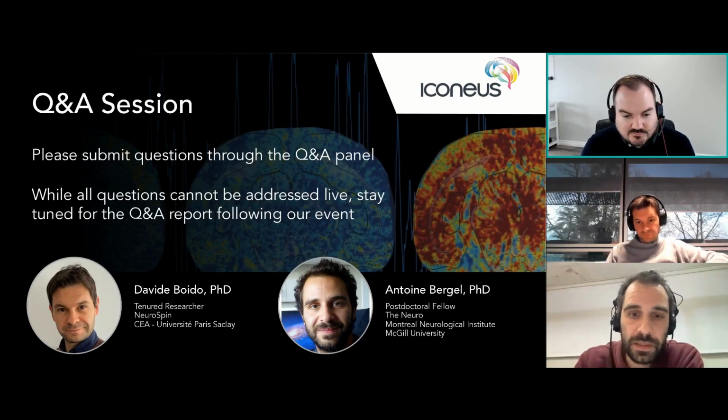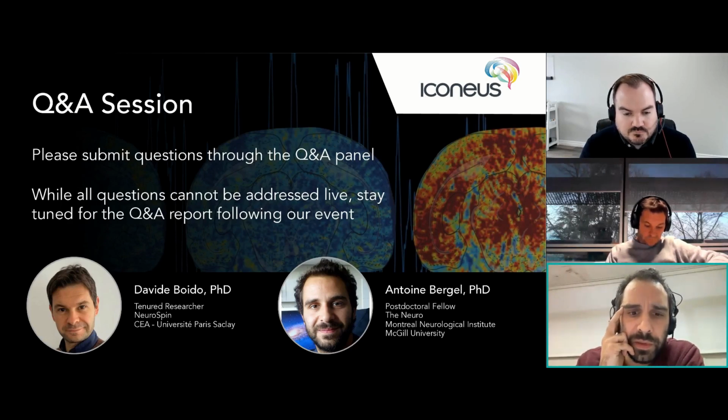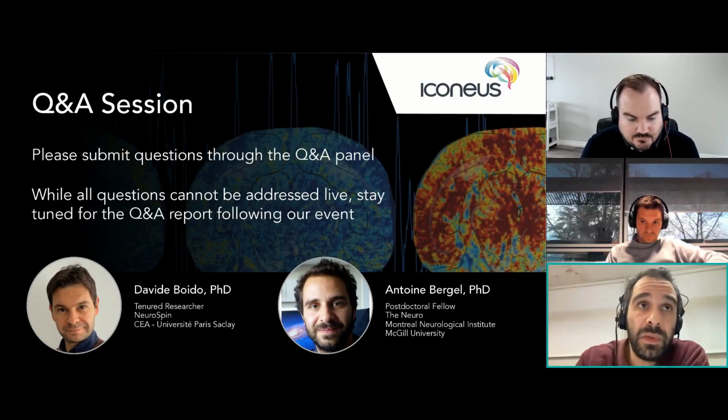Yes. And optogenetics, it's been done already. There's a paper published in Neuron 2021. Arnaud Sandublanc is the first author of that study. And with miniscope, nothing prevents it. Miniscope can be a bit bulky, so it would be 2 probes, but on the 2 different sides of the brain in rats, I think it's definitely feasible, yes.